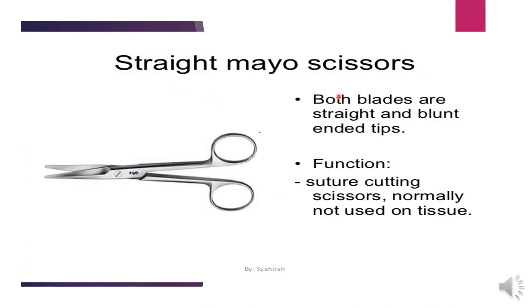Straight Mayo scissors have both blades straight with blunt-ended tips, and come in small, medium, and large sizes. There are also suture cutting scissors, which are normally not used on tissue. There are many types of suture cutting scissors in different sizes — small, medium, and large. We will see the types of scissors further.